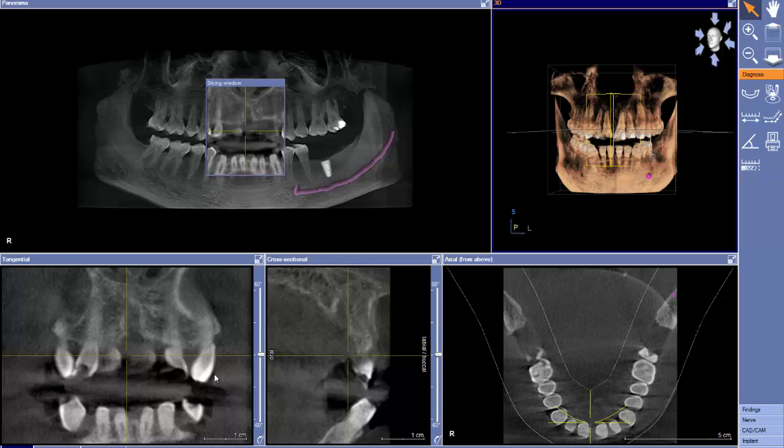It looks like I didn't have any instructions, but I make the assumption that it's tooth number 19. And it looks like you've done a pretty good job of marking the nerve. I went through that. It looks very nice. The first question I'm going to ask is, what is our restorative plan? Is it for a single tooth, a very large tooth, a small tooth?